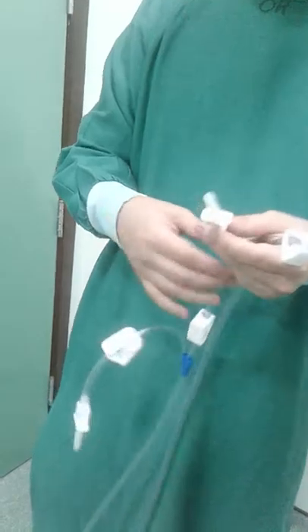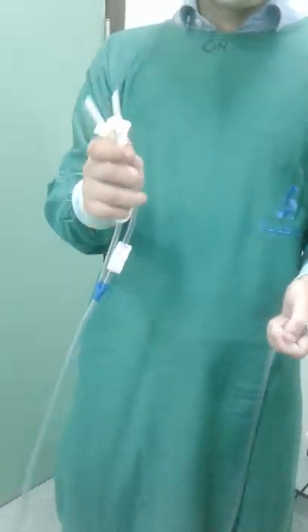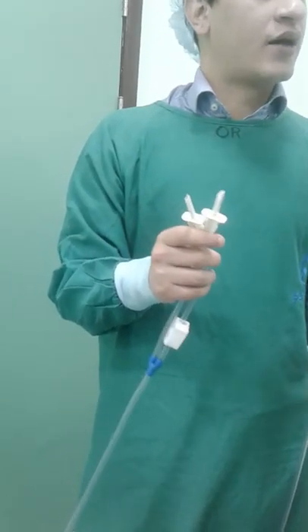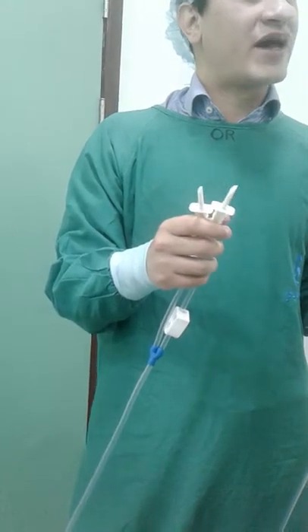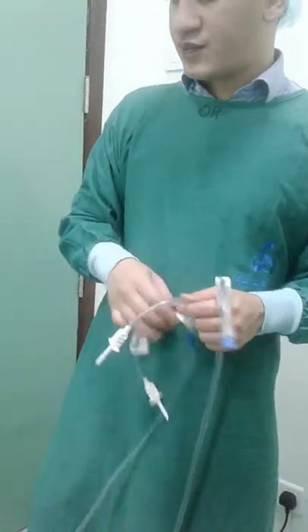So after this end there is a hysteroscope inflow port. And this other end goes to the irrigation bags. You remove this. The irrigation bag is to be hung here. Try to make it 10 centimeters, the height between the device and the bags. But if it's more height and it's working well, no problem.